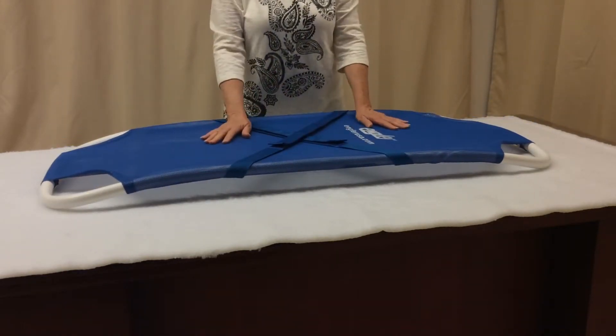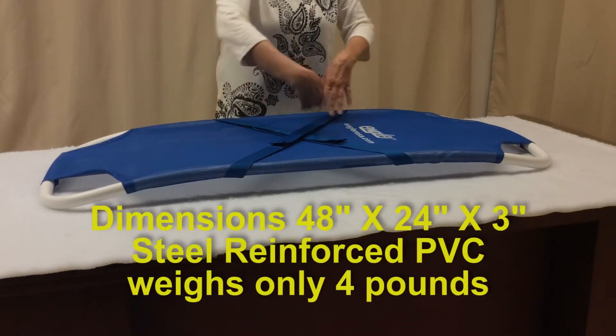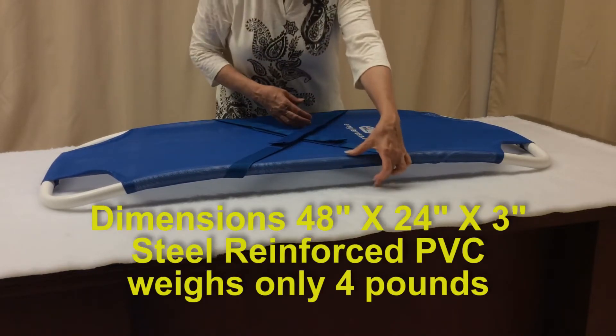The dimensions of this unique design are 48 inches long, 24 inches wide, and 3 inches high.